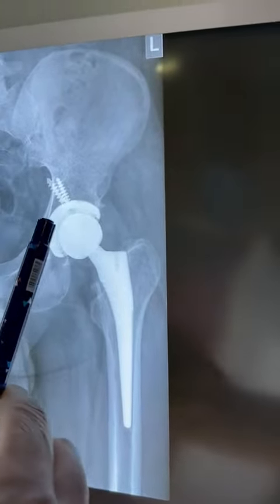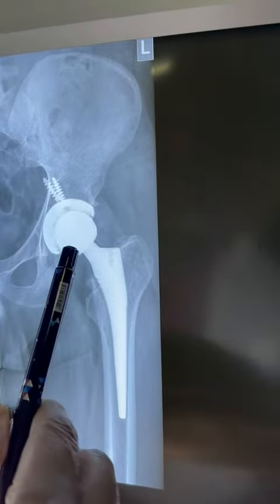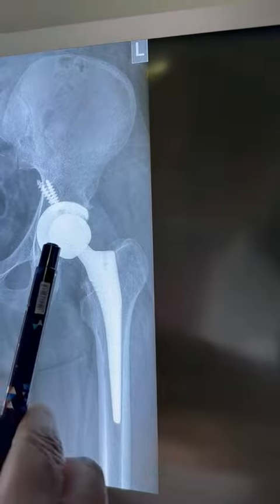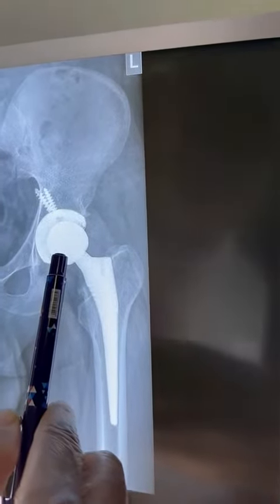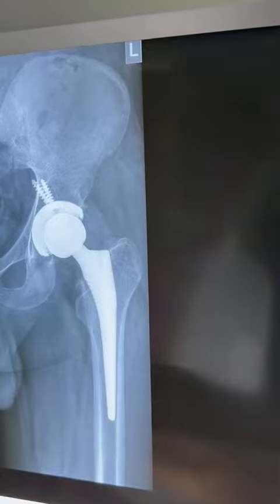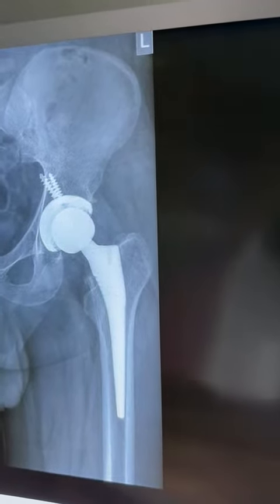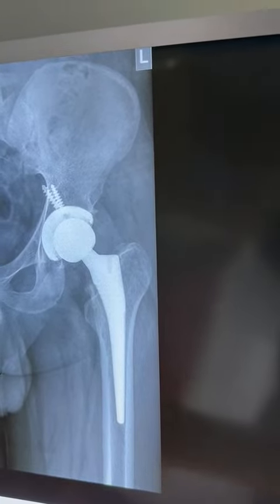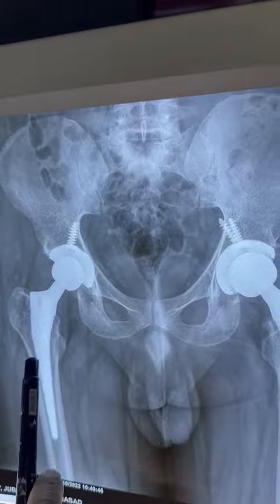This is an uncemented cup, which we fix using two screws, and this head is a ceramic head. The head size is about 36mm. Head size varies from 22mm up to about 36mm, which is ideal, but sometimes we use bigger heads. The right side also has an uncemented stem.